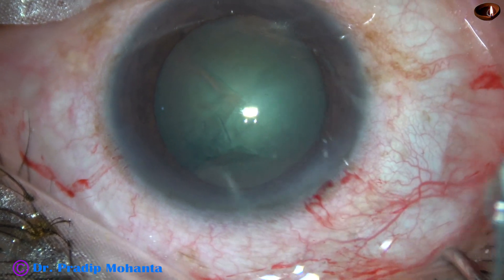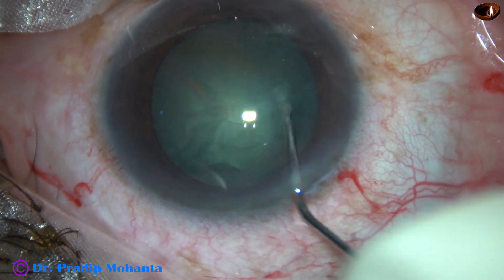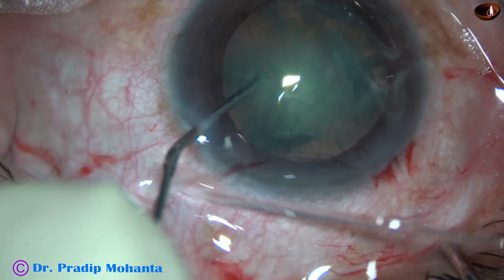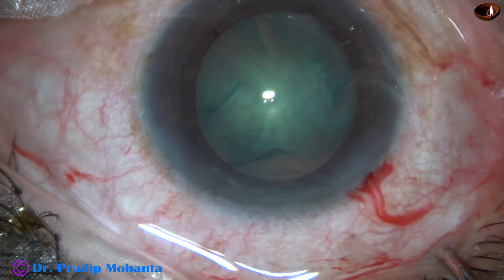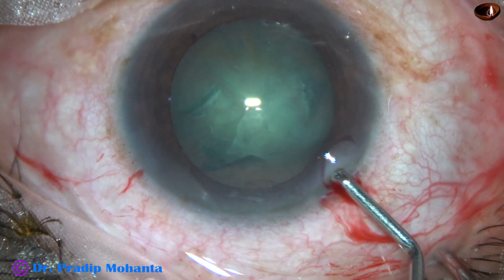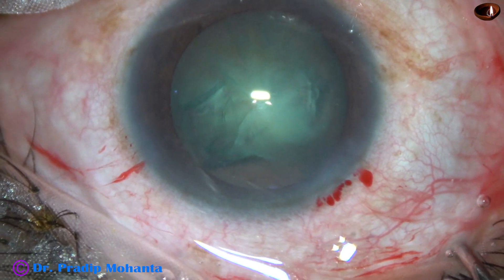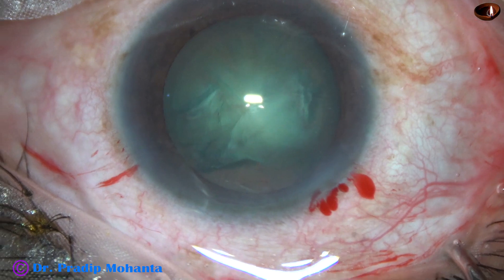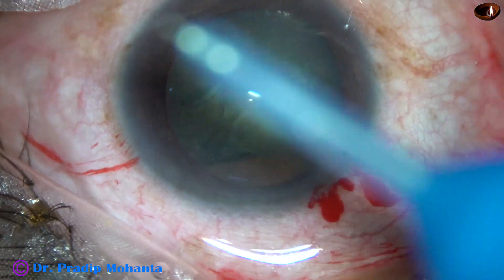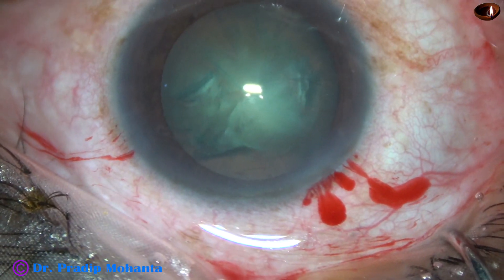Hydrodissection is done. As soon as the fluid wave reaches from one point of the equator to the opposite point of the equator, injection of BSS is stopped. Hydrodelineation is done, the nucleus is tapped, and a little attempt to rotate the nucleus is done. But in this case, my plan is to rotate the nucleus after aspirating some superficial cortical lens matter with the phaco needle.